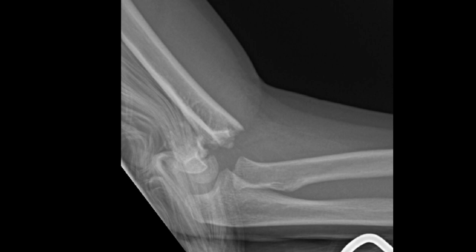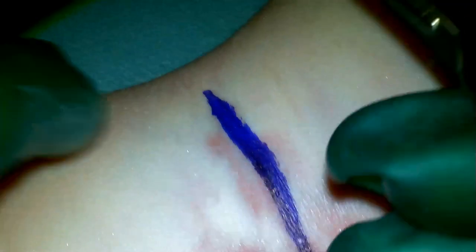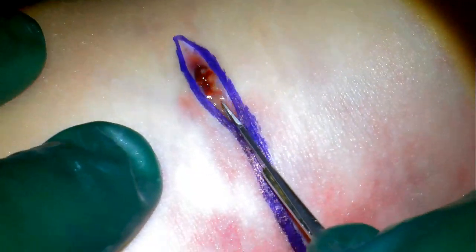She was taken emergently to the operating room. Here we can see that large intermedial ecchymosis, or the brachialis sign. Attempted closed reduction was performed, and this was unsuccessful. There was a soft, irreducible endpoint with a gap medially. Concerned that this could represent neurovascular structures, decision was made for an open reduction.